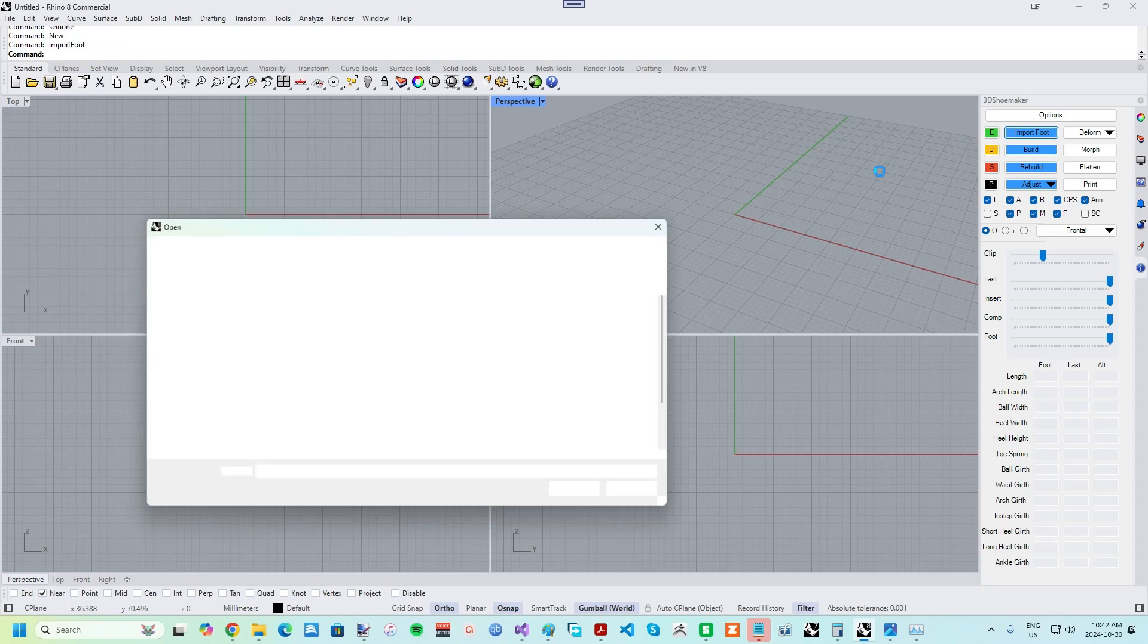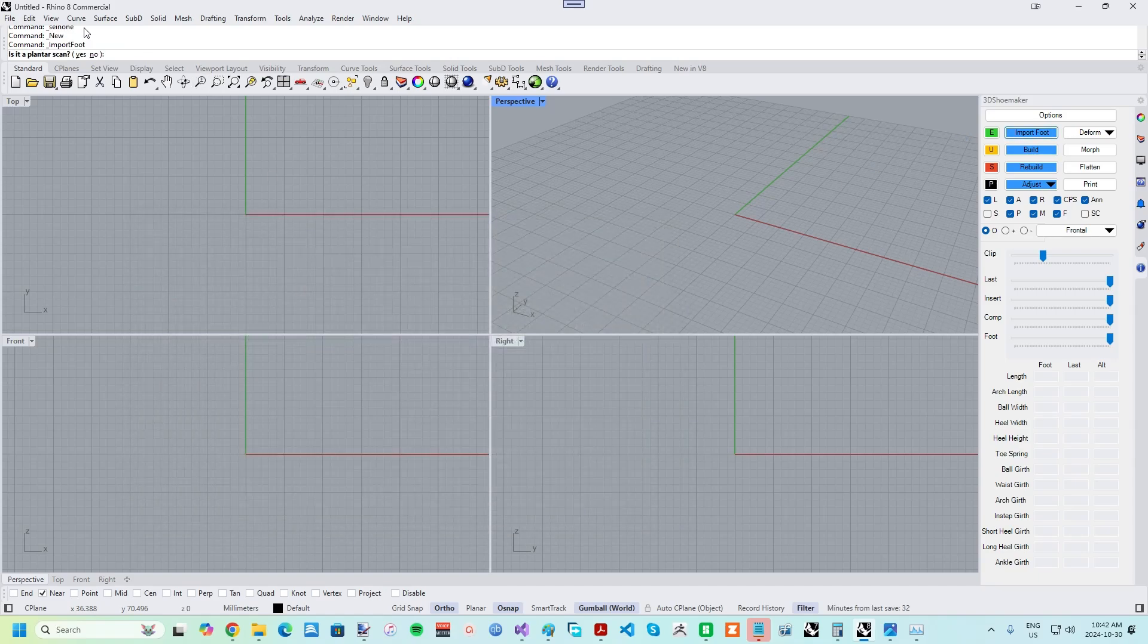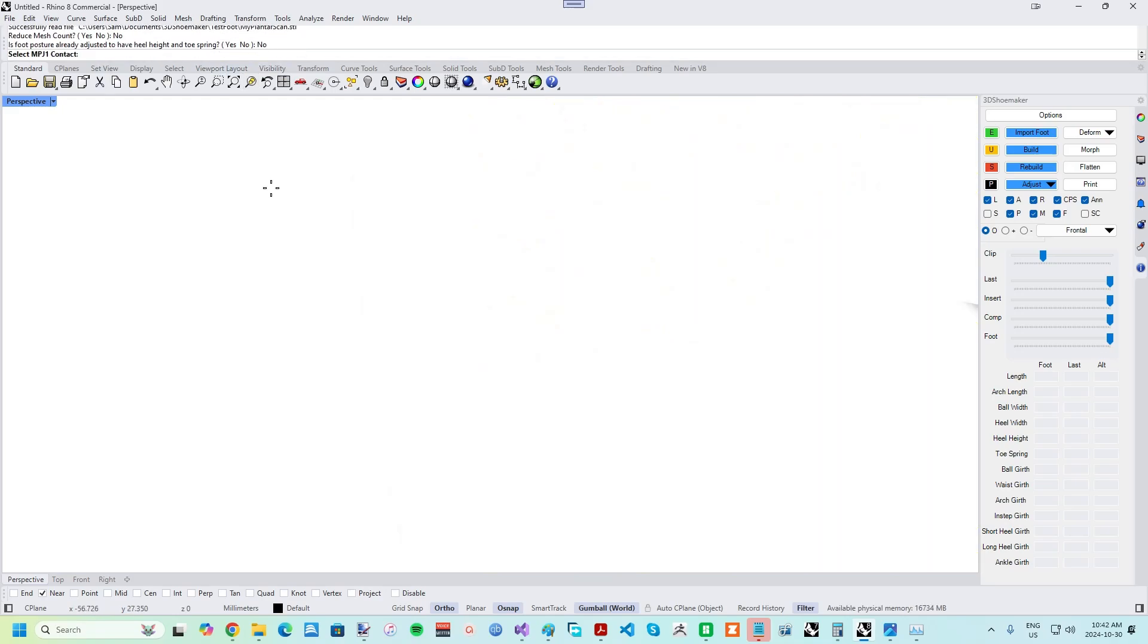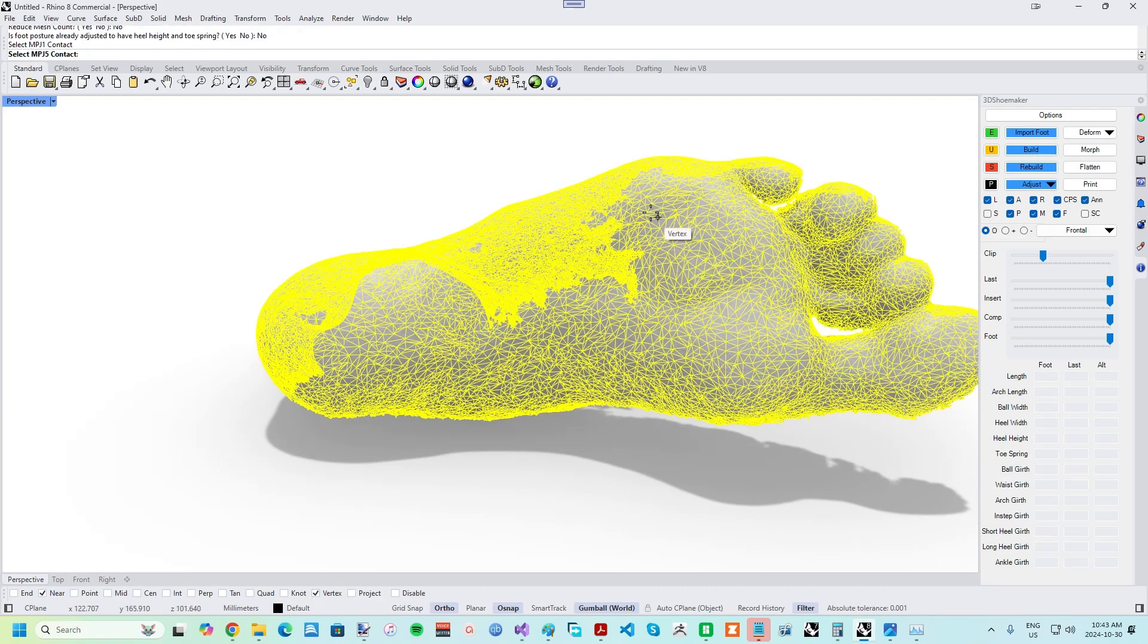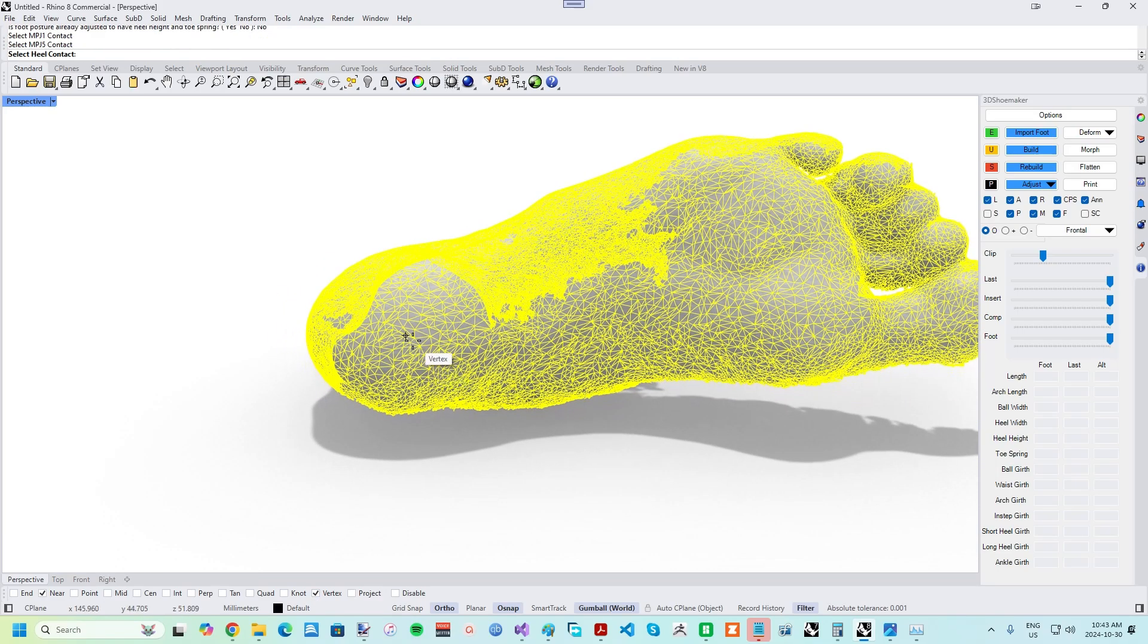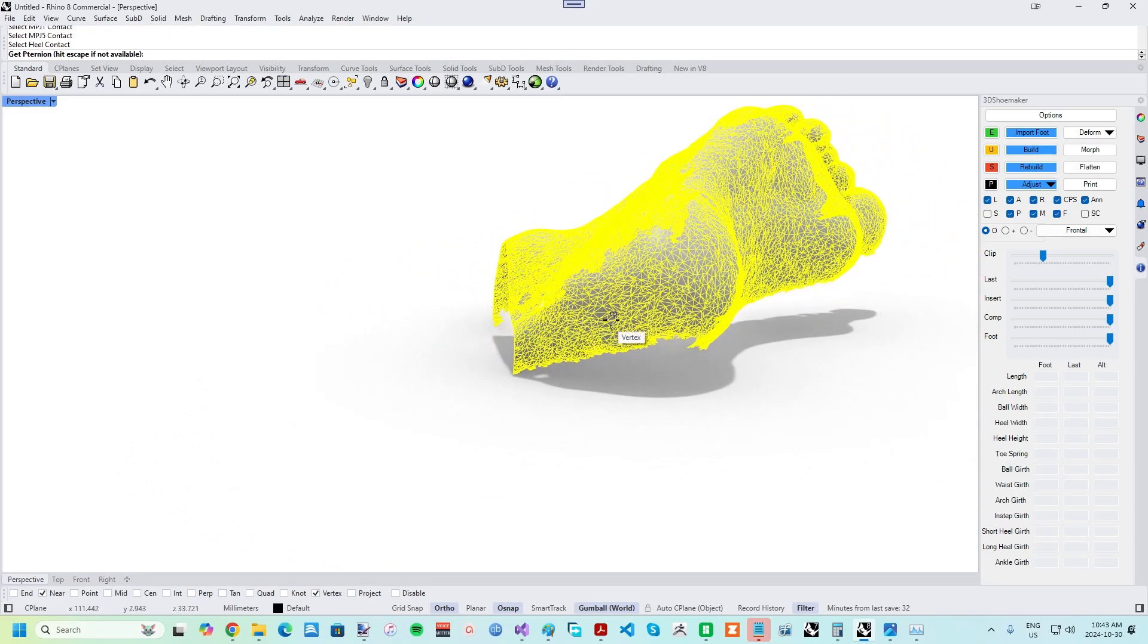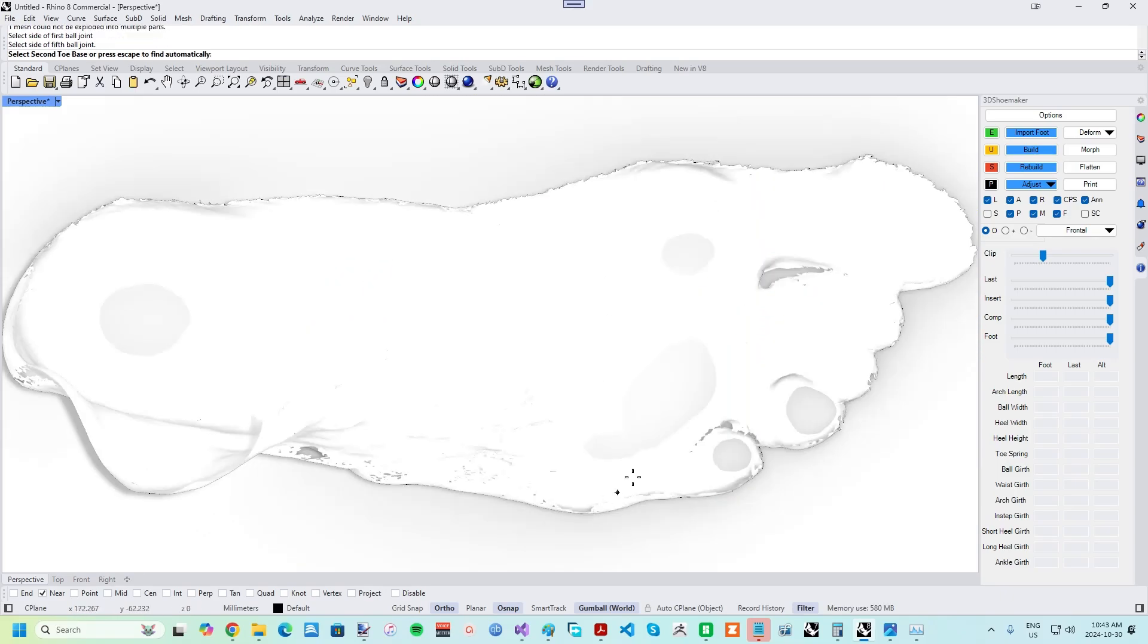Once you have a plantar foot scan you are satisfied with, press the import button on the 3D Shoemaker side panel, then select your scan STL file and follow the command prompts from there. You'll want to turn on Vertex OSNAP when selecting the approximate contact points. Once importing is complete, a form with foot measurements will come up. Note that the girth measurements won't be populated, given it is just a plantar scan being worked on.